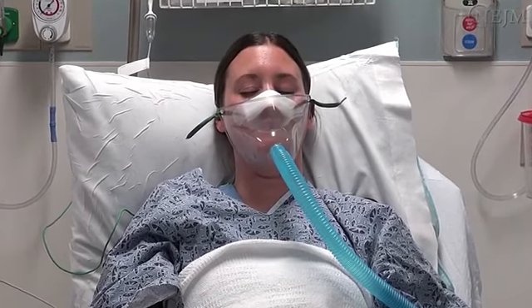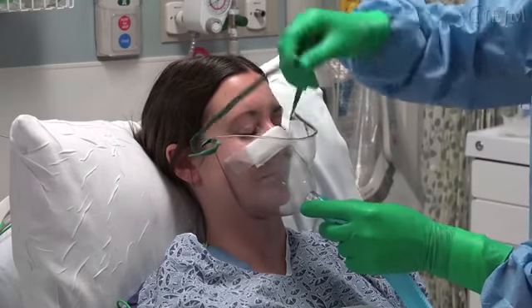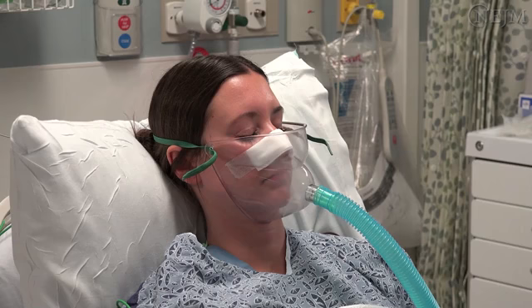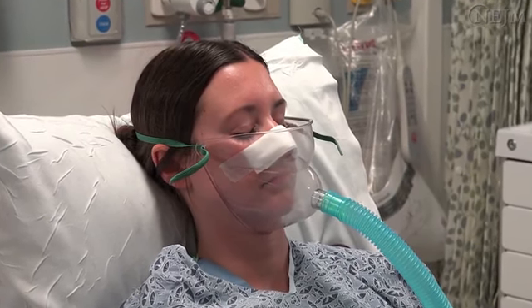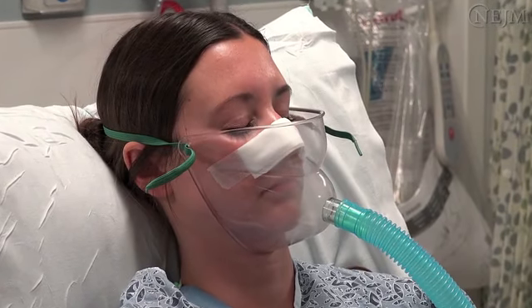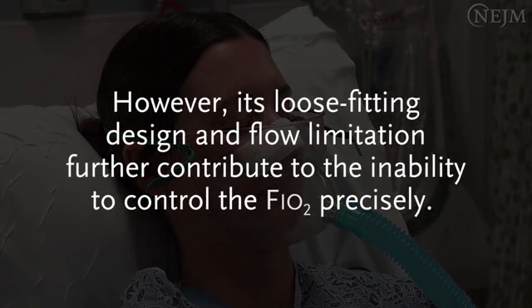A face tent provides a controlled concentration of humidified oxygen through an open mask that fits under the patient's chin, covering the nose and mouth without creating a seal around the nose. With a flow rate of 5 to 15 liters per minute, it can provide an inspired oxygen concentration of up to 50%. Placement of a face tent is ideal for patients who cannot wear a tight-fitting mask. However, its loose-fitting design and flow limitation further contribute to the inability to control the FiO2 precisely.